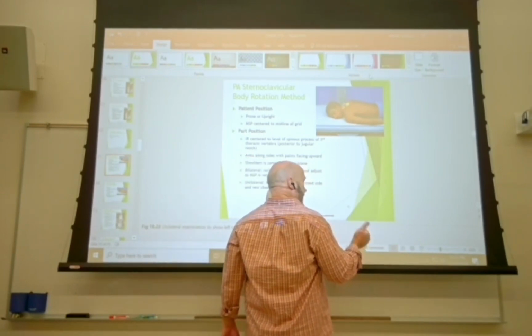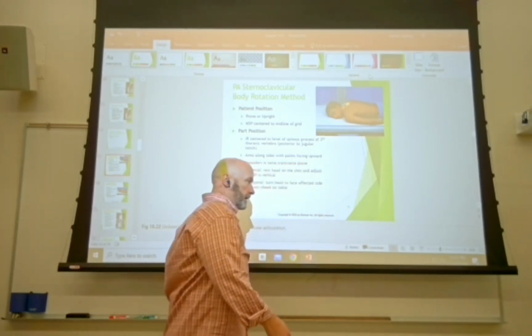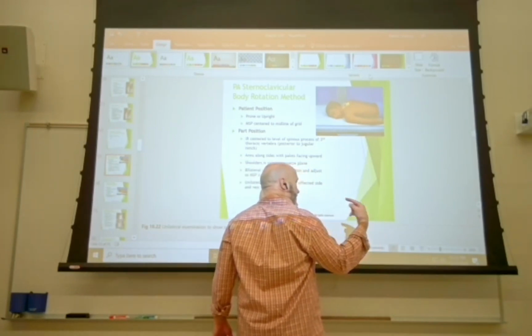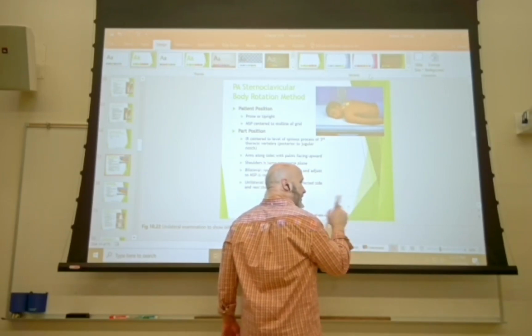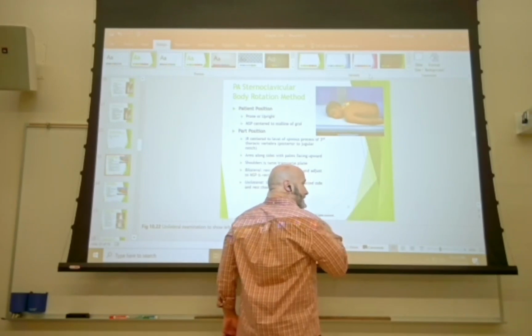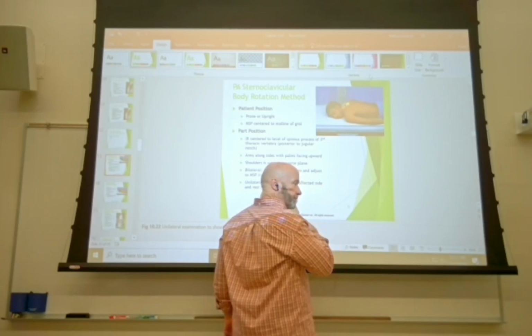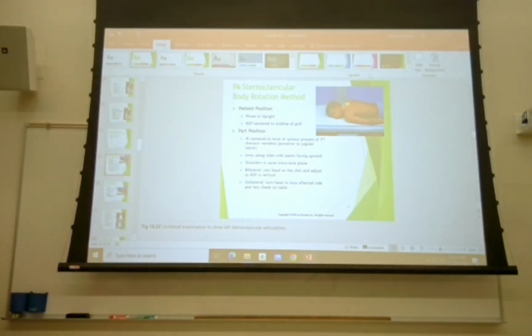Have them look to the right, make an exposure. Have them look to the left, make an exposure. As I look in one direction, the spine's going to move in the opposite direction. So whatever side I'm looking towards, I'm going to see that sternoclavicular joint. The body's going to oblique just slightly, so on the elevated side, I'm going to see that sternoclavicular joint. Okay, so bilateral. Look to the left, make an exposure. Look to the right, make an exposure.